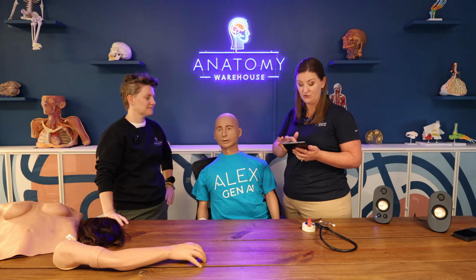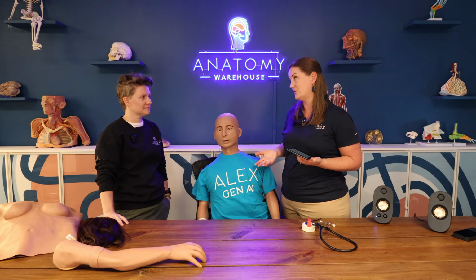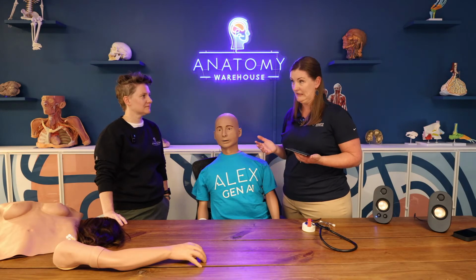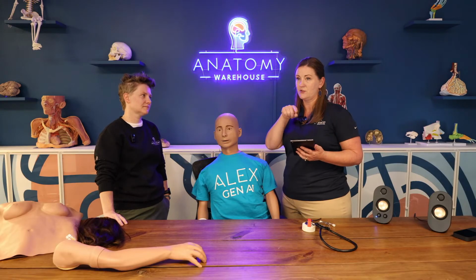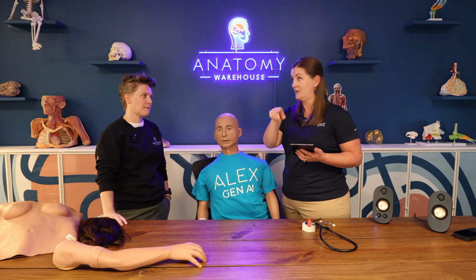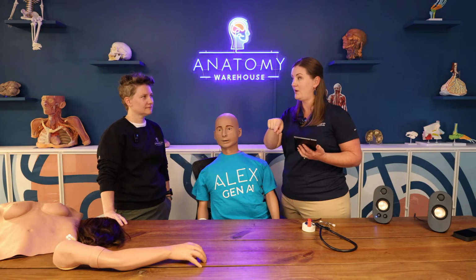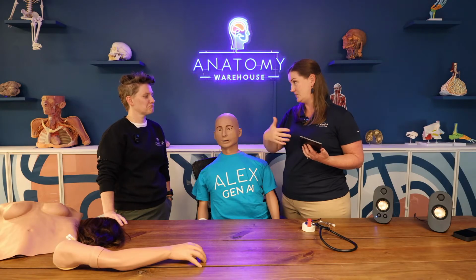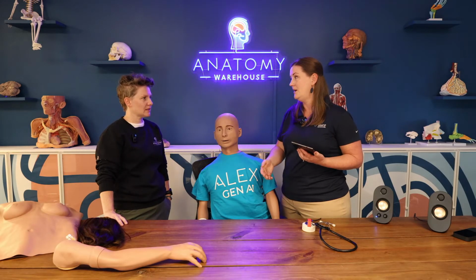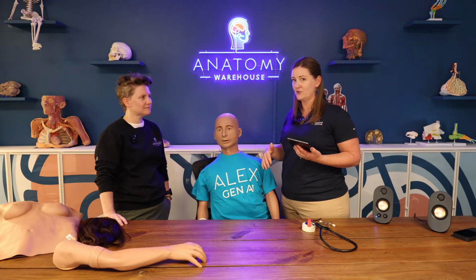They also can do different things as far as talking through the mannequin. So maybe they have a student who is a little underconfident and they're frozen and they're not quite sure what they're supposed to do next. The instructor can use their voice and talk through the mannequin as well and say, listen, student Liz, I think the next thing that you might want to do is take the mannequin's blood pressure, so they can help guide those students in a vocal way as well. So they're not standing over and hovering over their students. They can actually be very comfortable in their own office.